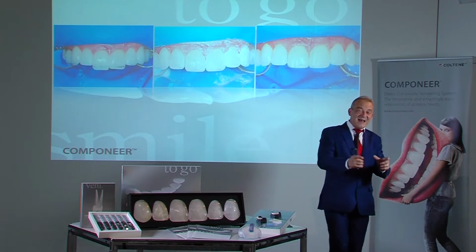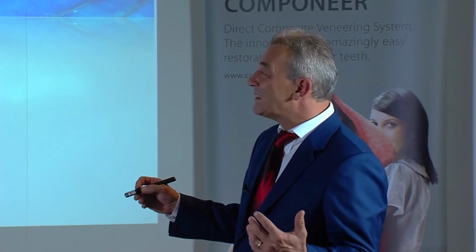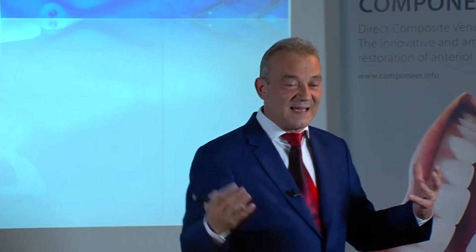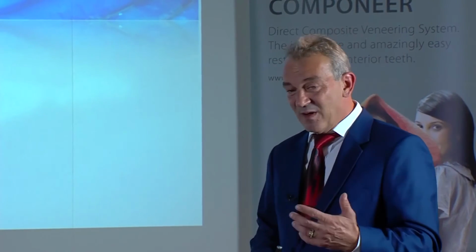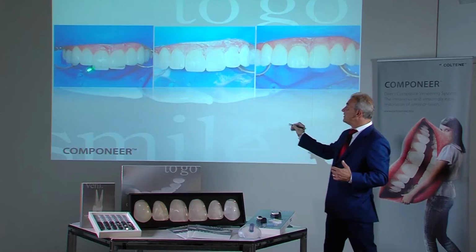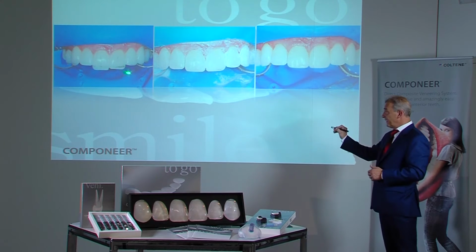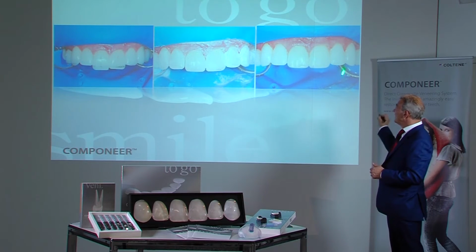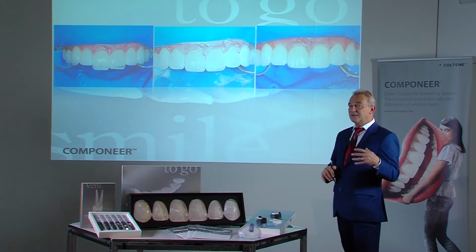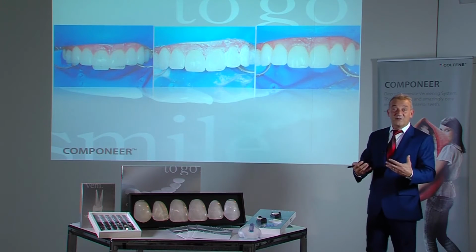Now that the teeth have become a bit wider, the componeer M expected for the middle teeth would be too narrow. Because of the mesodistal width, a componeer L was used to cover the surface entirely. The componeer L are then, of course, too long, but they can be shortened. Tooth proportions are always distorted slightly in the case of diastemas, but one cannot retain the proportions in all cases, otherwise the teeth would become far too long.